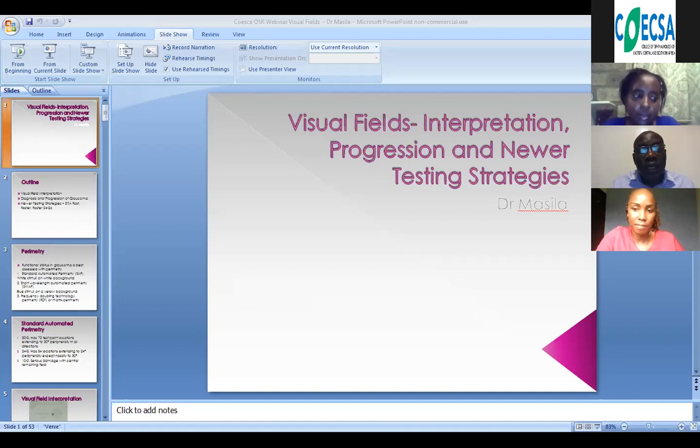Okay. Thank you. Patrick, I think this question is asking, at which interval shall we do visual fields following a glaucoma patient? Yeah, so fields, in general, like glaucoma, you have to tailor it to the patient. So understanding their cooperation, fatigue.